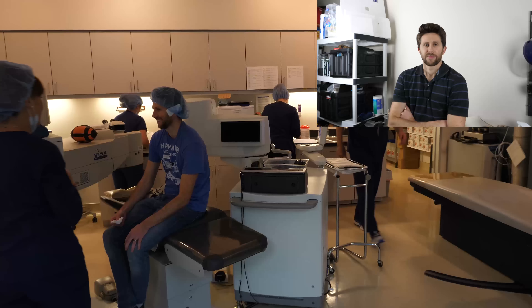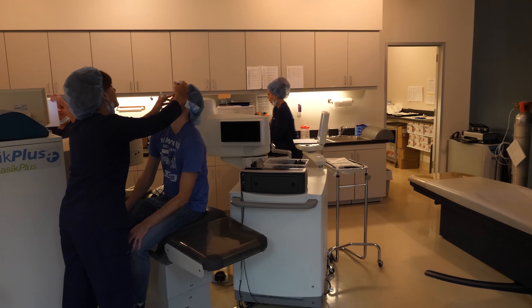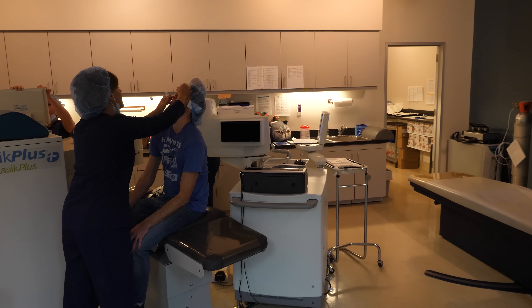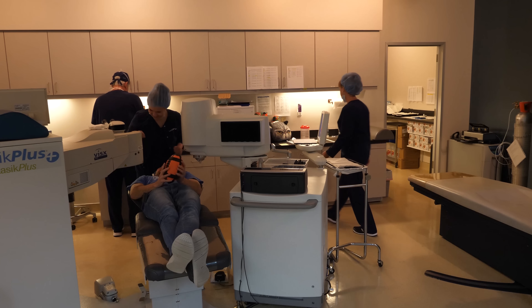Okay, holy cow — here we go, about to go into the OR and get operated on. First they put in the numbing drops. And the nurse says: if you feel like squeezing your eyes, just squeeze this stress ball instead.